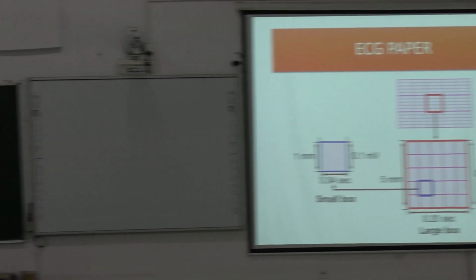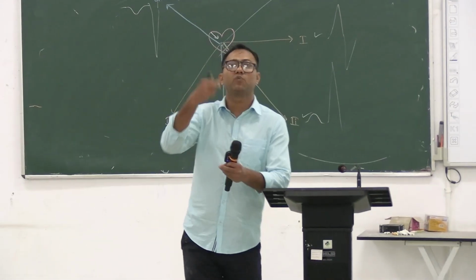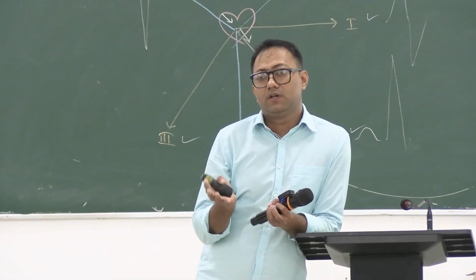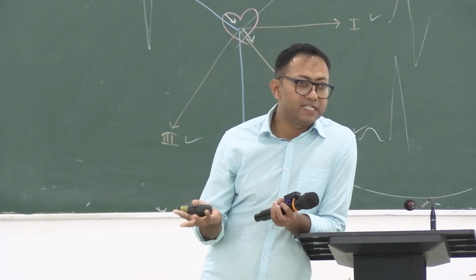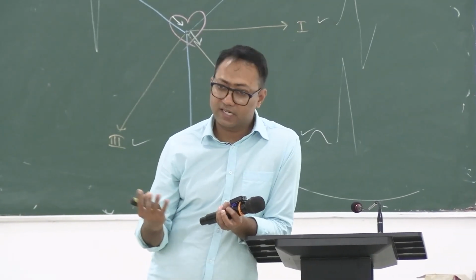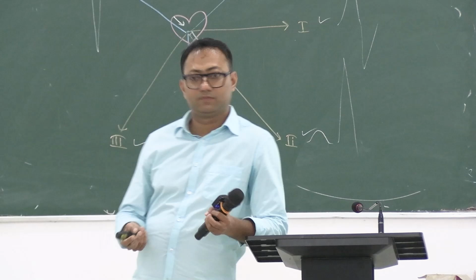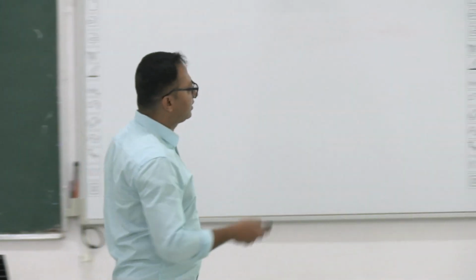Correct? 1.5 millivolt. As आपको पूछा जाएगा during practical examination, you will be given one ECG strip of a patient or of a normal subject, right? And we will ask you, tell me the voltage of R wave in lead 2. Okay? Or the examiner can ask you, tell me the PR interval, right? In this way. Okay, I'll come to PR interval later on.